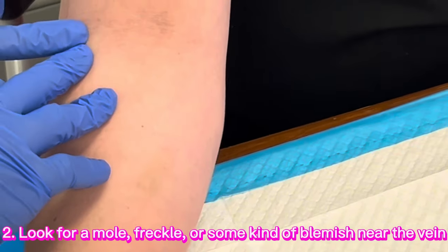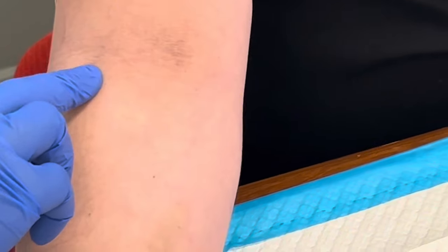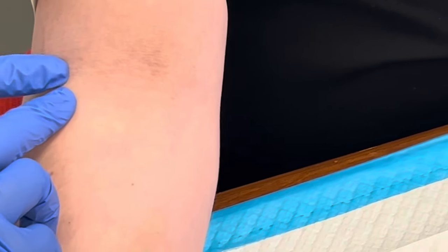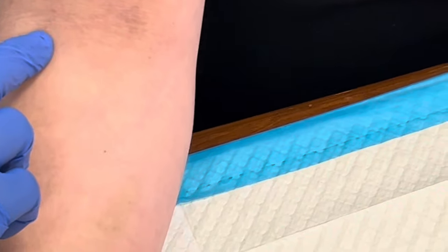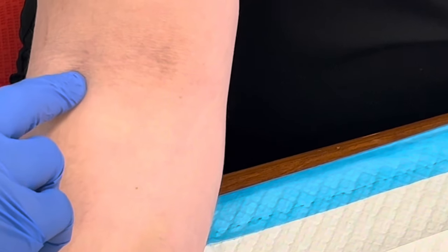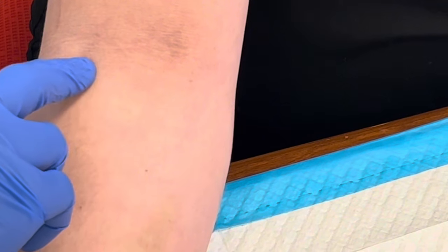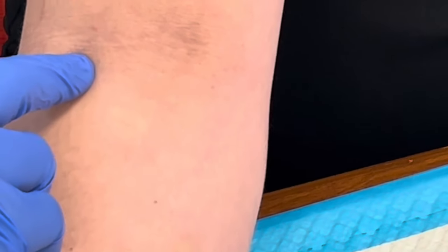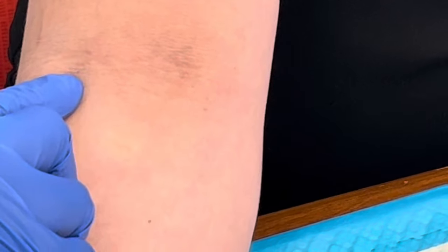In her case, I feel her vein right here and I see just a little blemish — a little mark right there. So I know that I'm going to go right below that mark. Remember, X marks the spot? That's how I look at it. It's right below that little speck there. So when I clean it, I know I'm going right below that speck.